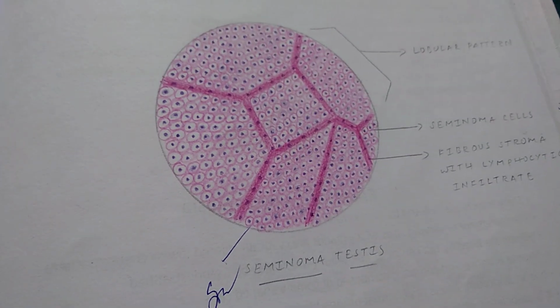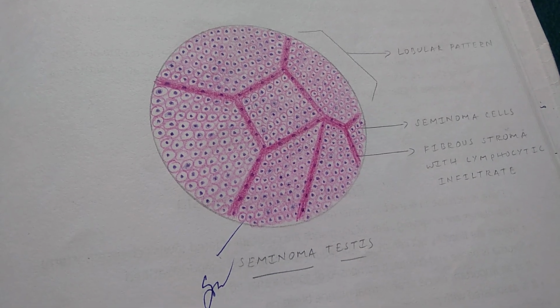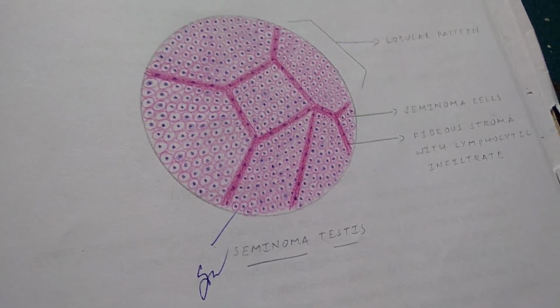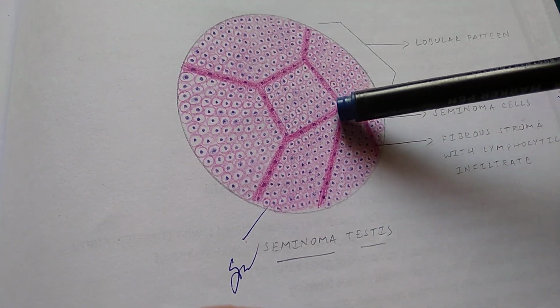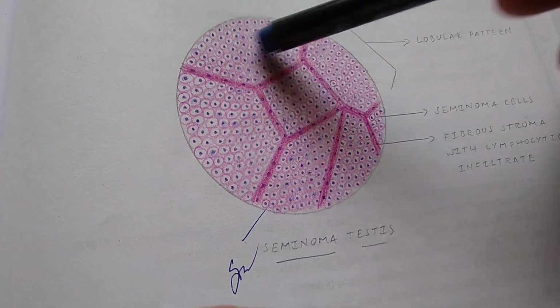This is beautifully drawn. What is this? Seminoma testis. Okay. So this is a common malignant tumor of testis. Most common malignant tumor of testis. Let's focus. Are you listening? This is seminoma testis. So beautifully drawn.